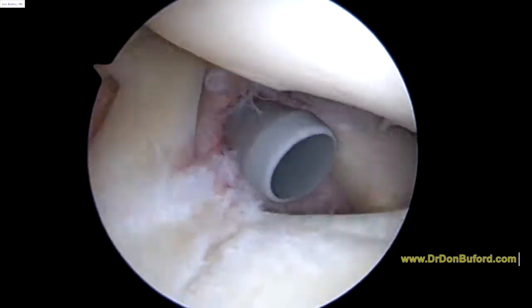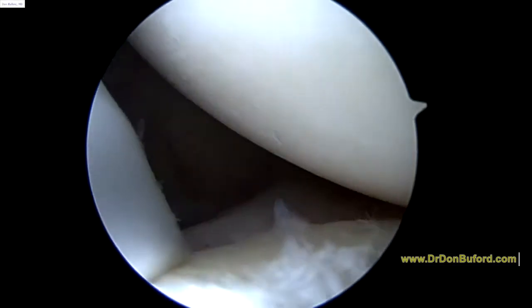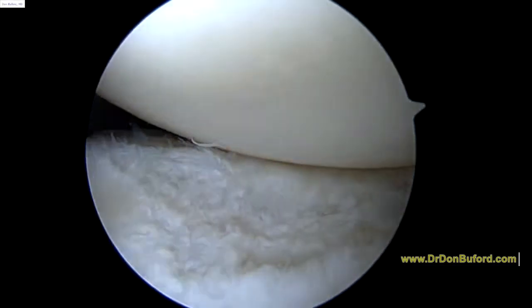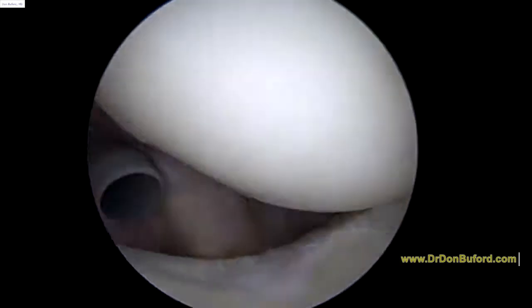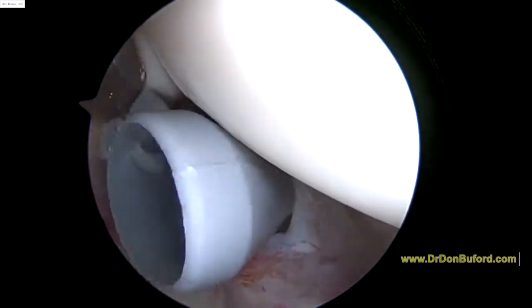So now we're done with the debridement of the cartilage. We've examined the labrum pretty closely, and even though the IGHL attaches right there, that labrum is stable — so that's good news. Let's look around the back there, and now we're going to come back and make our decision on the biceps tendon.